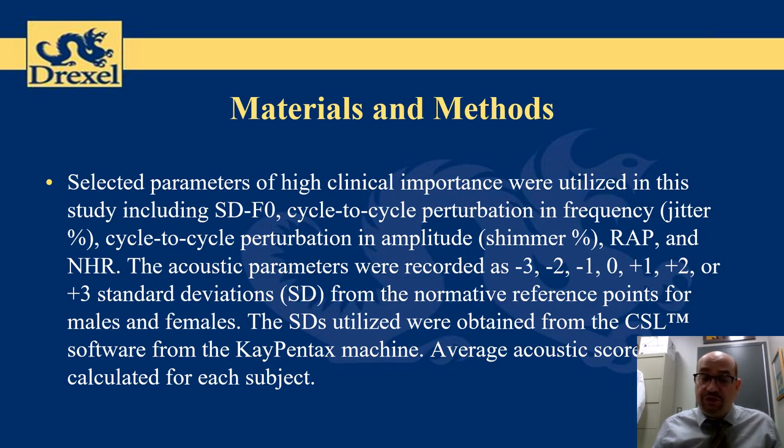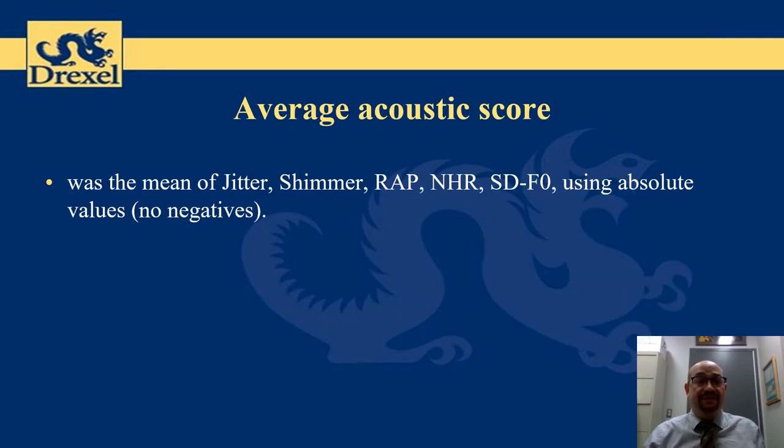The standard deviations utilized were obtained from the software from the K-Pentax machine. Average acoustic score was calculated for each subject. Average acoustic score was the mean of jitter, shimmer, RAP, noise to harmonic ratio, and standard deviation of fundamental frequency using absolute values.